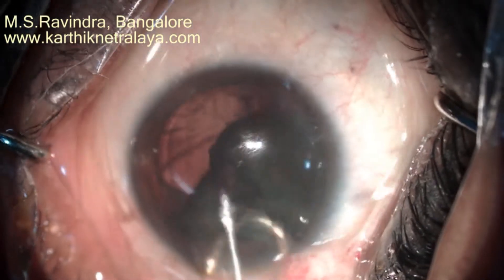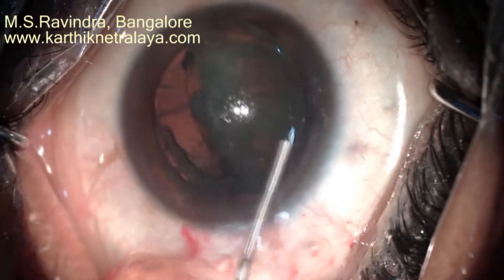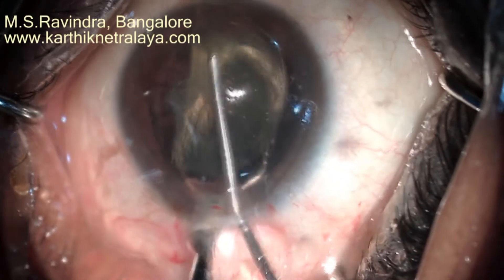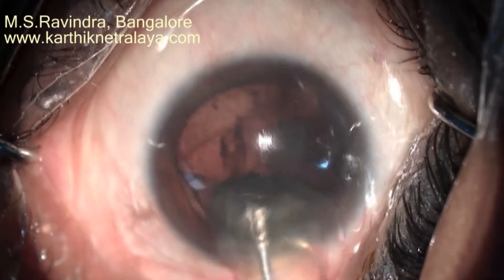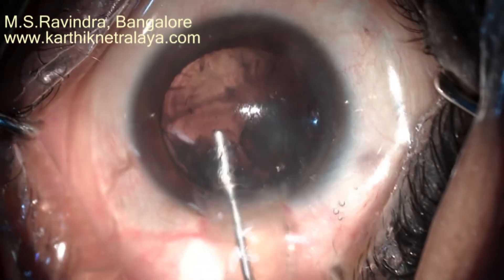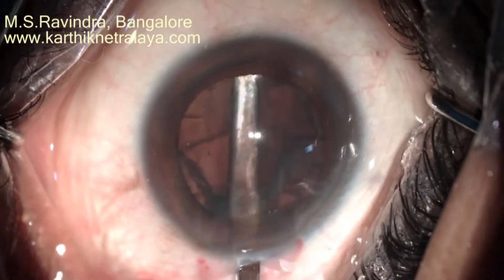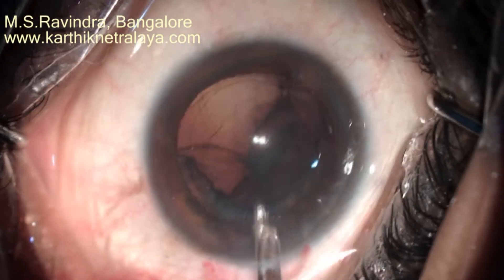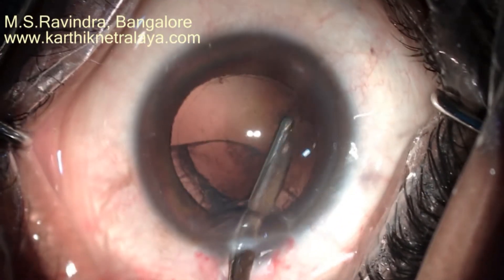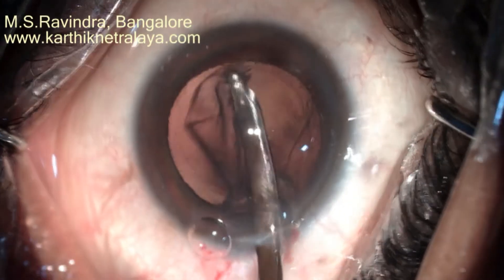A mini vectis supports the hemi-nucleus. The nucleus is bisected into two halves using the shaft of a 25-gauge cannula. Visco is continuously injected into the anterior chamber to protect the endothelium against the moving nuclear masses. Due to capsular-separating hydrodissection, the capsule is separated from the cortex, making cortical aspiration straightforward.